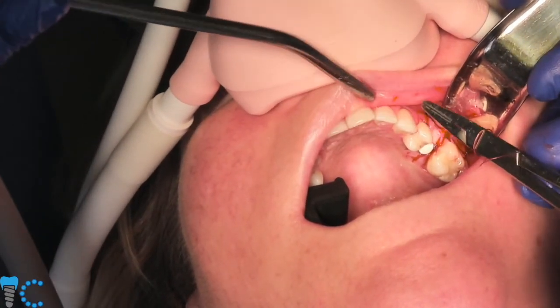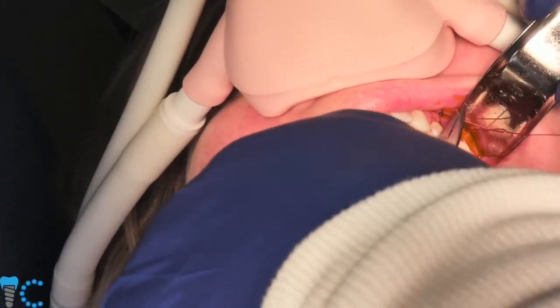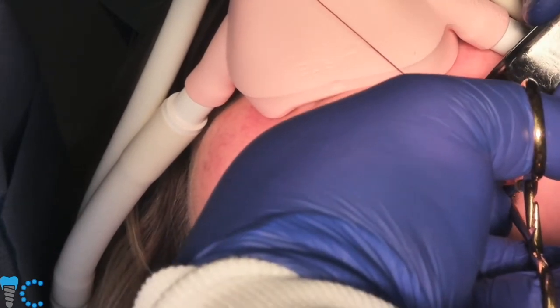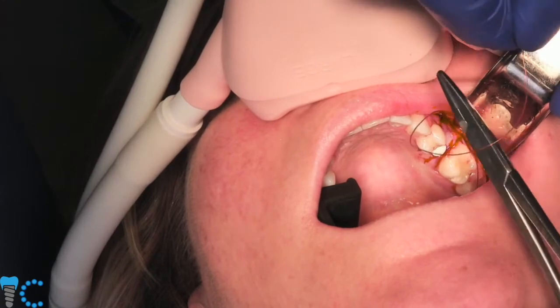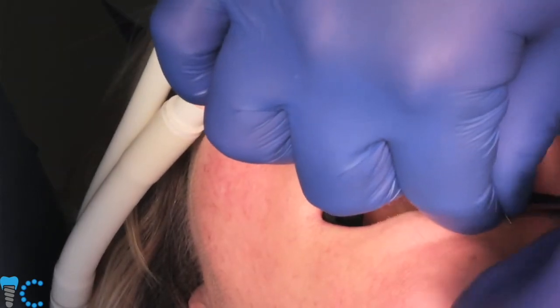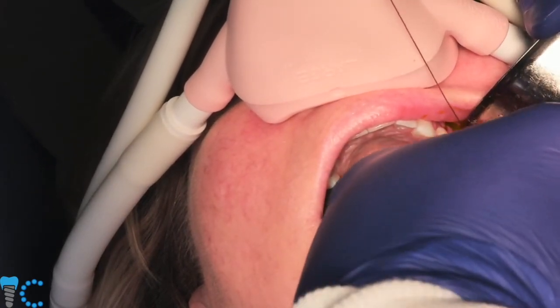Even though when you really break it down, the ceramic can save you a little bit, realistically the cost to manufacture the product is more expensive. But the truth is, compared to other implant systems, this doesn't cost any more than it does to use other systems. So what is the Z5C implant?